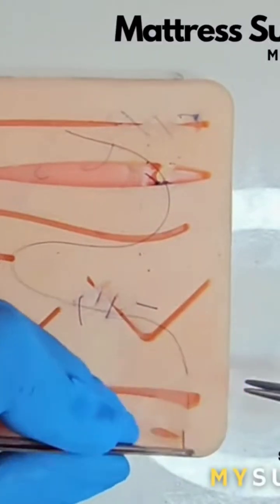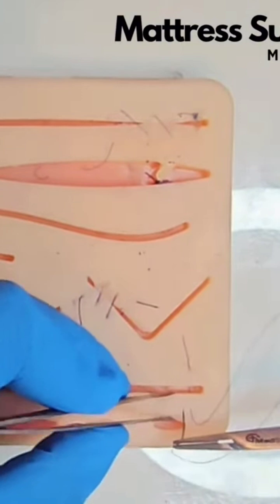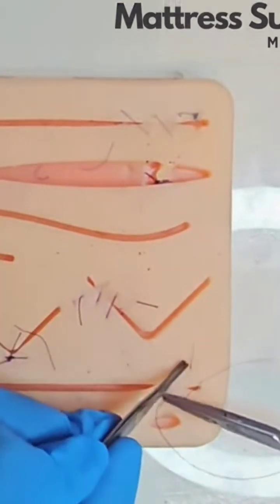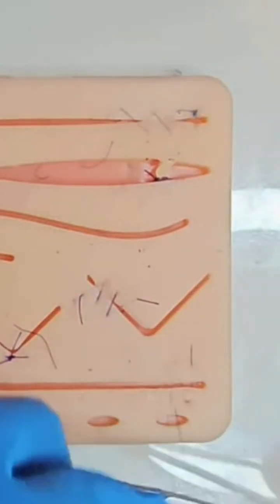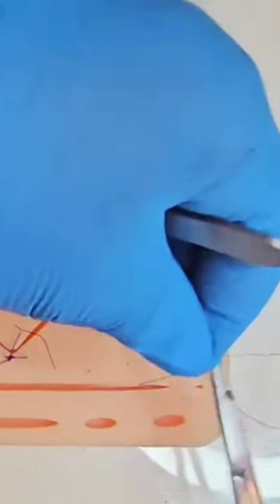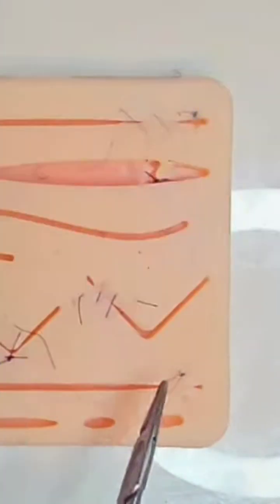The horizontal mattress: you go across the wound like an interrupted, but you take two further bites. The third next to the second, heading back across the wound and exiting opposite and next to the first. You perform your surgeon's knot followed by two reef knots. This is excellent for wound eversion.